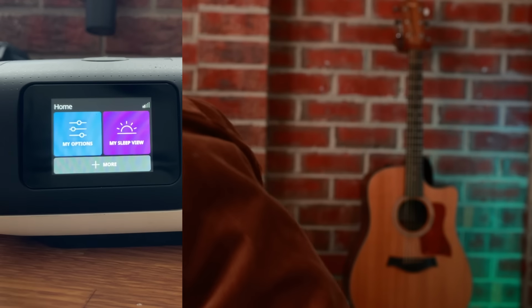And if you add, I highly recommend you do, a tube cozy. This one here is from Pat a Cheek. So good, so good. Expensive, but damn, this is the best by far. Gets up to like 95. So if you're struggling with rain out in a really cold environment, this is it, my friends. And when you connect this to your ResMed, in the settings, you can then change from slimline to standard. What are we up to?